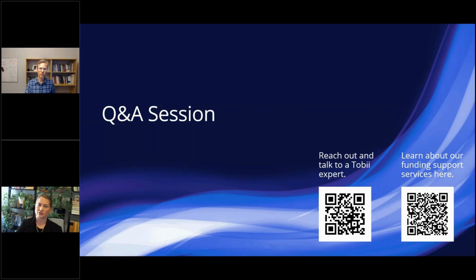Okay, that's great to know. So for people who are using our wearable Glasses 3, we don't have the eye openness signal, but you can still use the pupil diameter. And since the eye tracker is on the face and not moving, you don't have any issues with the Z coordinates of moving eye trackers. So you can use pupil diameter blink metrics that are available on GitHub. Awesome. Great. I see a thumbs up there.